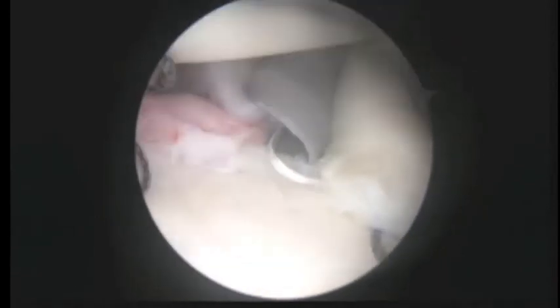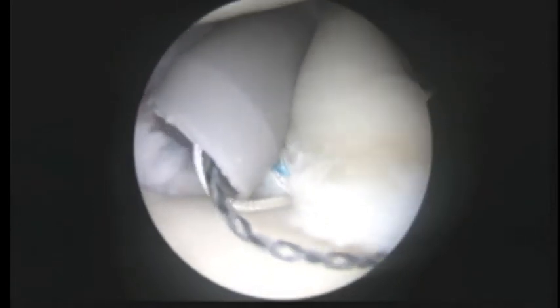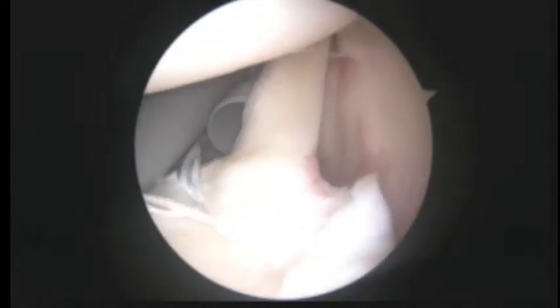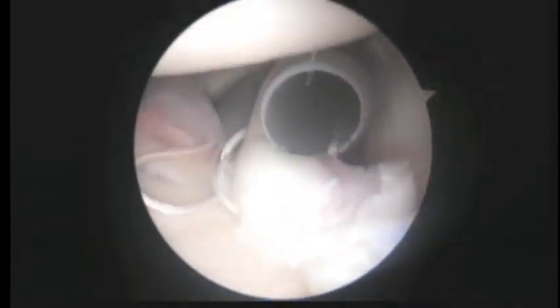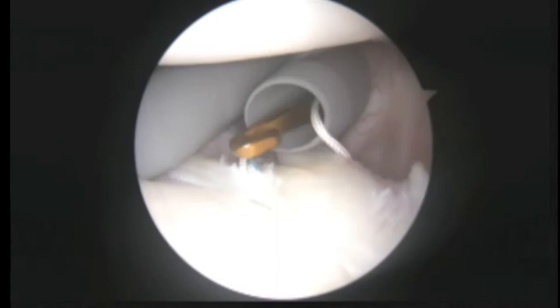Past the relay. And then outside your shoulder, we'll load that. Pull back. And that looks pretty good there. And now we're gonna reach in and get the partner suture. The other white one, that is. Right here. Okay, and so that's gonna be our first knot.